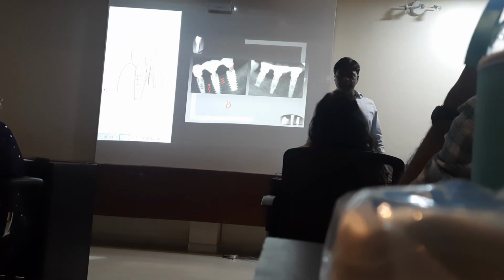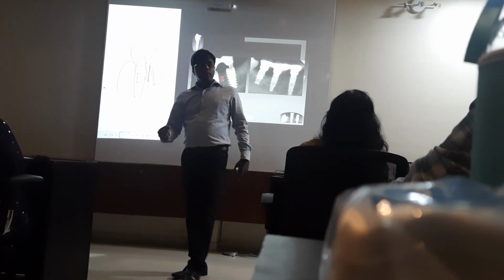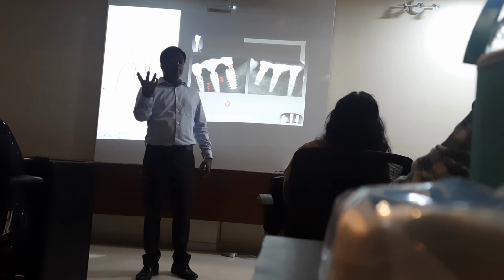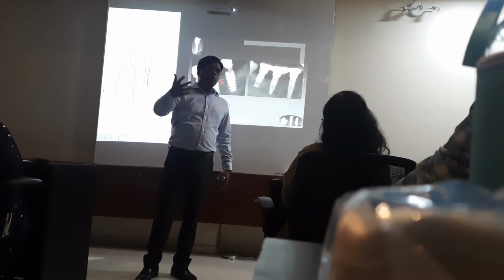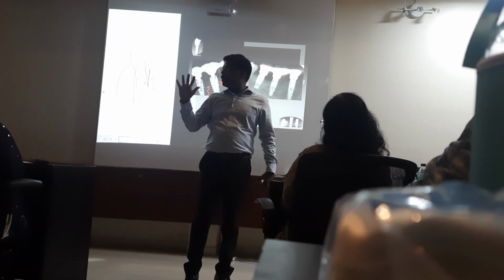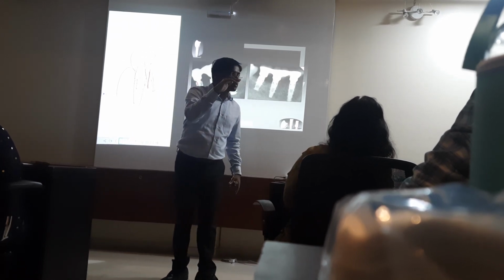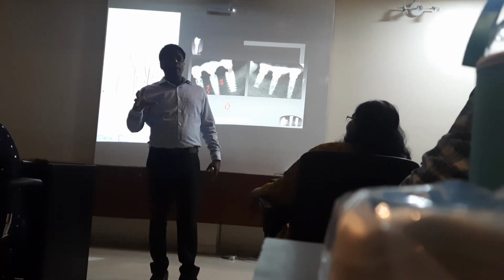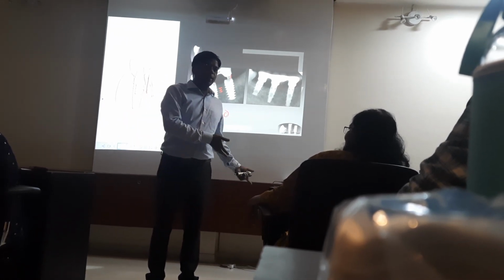Now the patient, as you said, no problem, it can be done within 5 minutes, he is relieved. He may not come the next day. What happens? Suppose the patient is continuing, the tooth is in the crown, in occlusion, which is moving, the screw is loosened, and instead of the next day, he is coming to you after a month. So slowly the loosened crown which is in occlusion, what happens? It starts shaking, bending. It bends. And the bent screw will find a fracture. So, if you knew it was only 5 minutes' time, you should have corrected it at that time only.